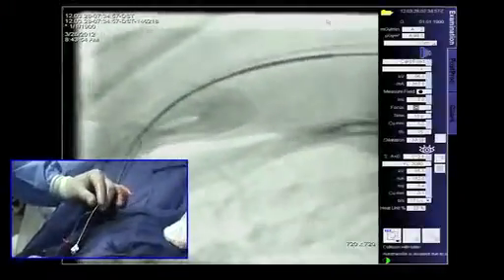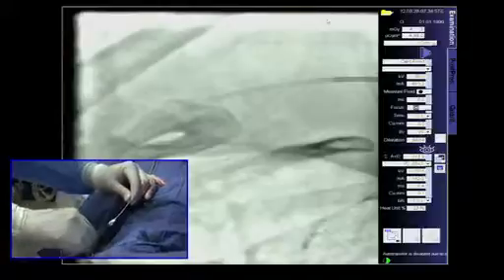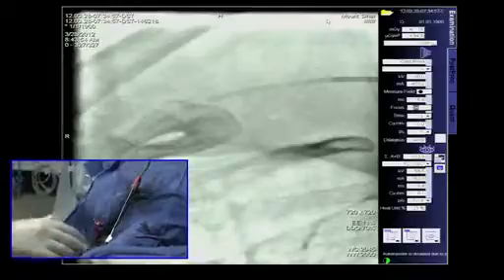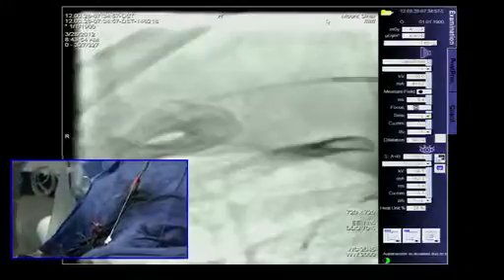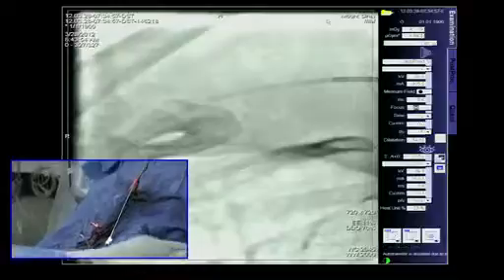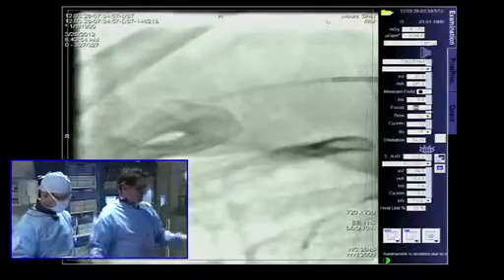So as you know, now we're going to go way out here, and now we're going to pull the wire out. Now we've actually lost wire position distally, which is okay, because we've got our supercore ready. We know we don't have a perforation, and now we're going to go ahead and do a picture that George wanted, so this way we can demonstrate to you exactly how this is. Watch your knees, guys. Okay. All right, Ray, DSA, please.